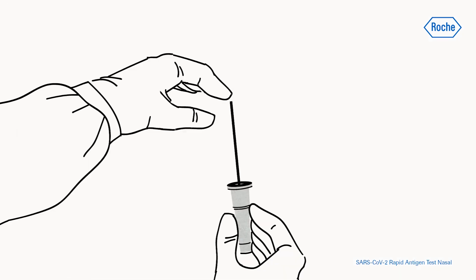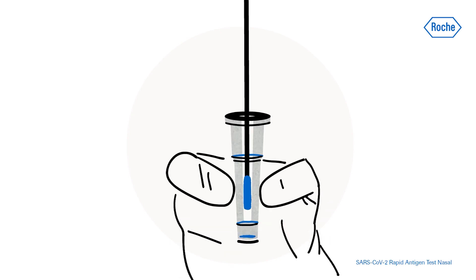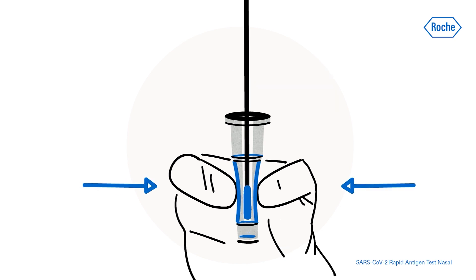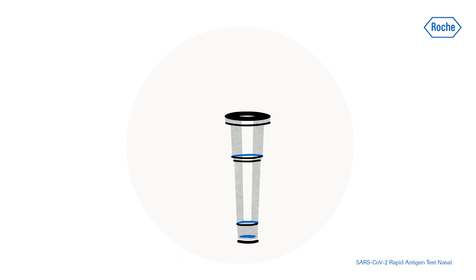Insert the swab into an extraction buffer tube. While squeezing the buffer tube, stir the swab more than 10 times. Remove the swab while squeezing the sides of the tube to extract the liquid from the swab. Press the nozzle cap tightly onto the tube.